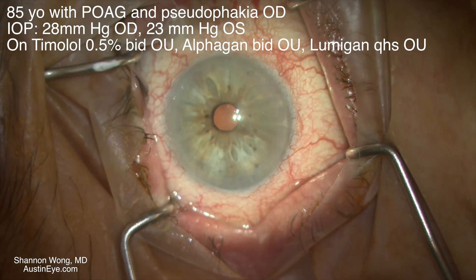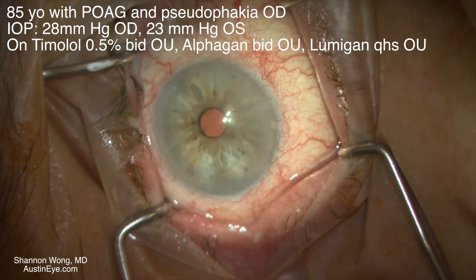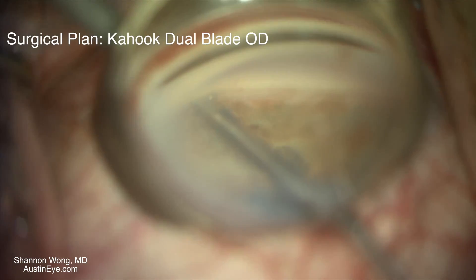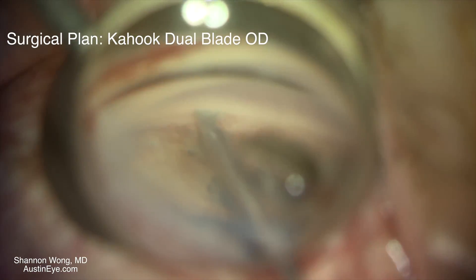This patient had undergone prior cataract surgery and had glaucoma with elevated intraocular pressures. This shows the same technique of placement of the Kahook dual blade.